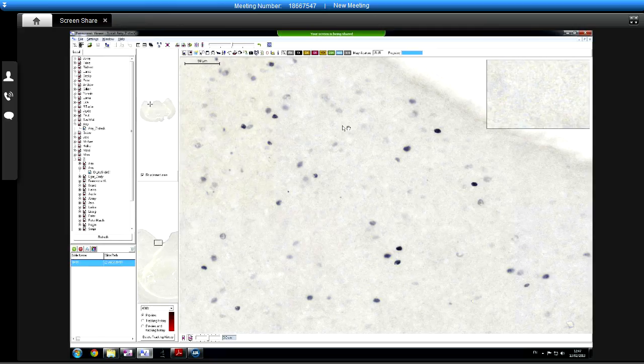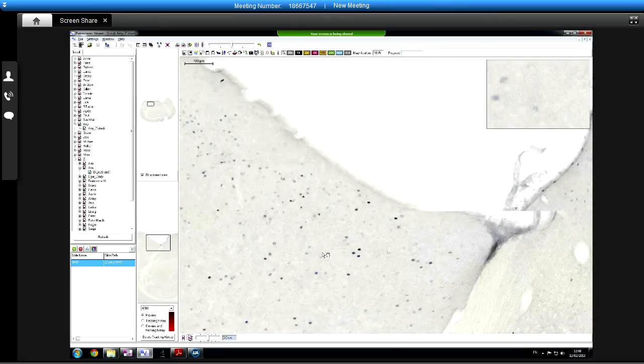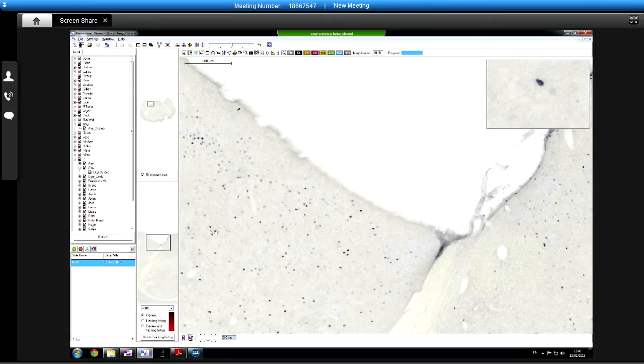On these ones, I also wonder whether, when you're setting it up for this stage, sliding the one that takes the noise and blurs it all the way to the right might help a bit more, because it might just push these out of focus even more into the background. Yeah. So you only can. I mean, saying that, if you were only to click on the nice dark ones when setting it up, they're clearly a different colour to these anyway, aren't they? So if you decided that just counting the nice dark ones still gave you the right trend between really positive samples and negative samples and control samples and all that sort of thing, then that might be good.